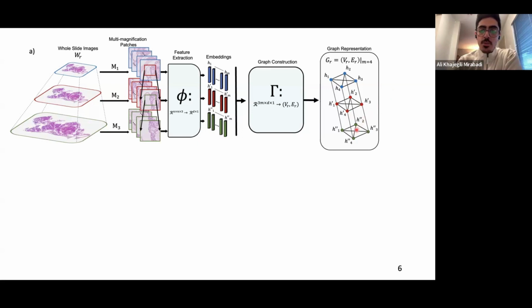The idea is that we cannot limit the lower magnification, but we can put a limitation on the higher magnification. For example, for 20x, we can put this condition that no patches in 20x overlap, but overlapping in 10x and 5x is inevitable. So yeah, patches in 5x and 10x will have overlaps. But still, it depends on the number of patches that we extract there. If we don't extract too many patches, there is a chance that we don't get any overlap.